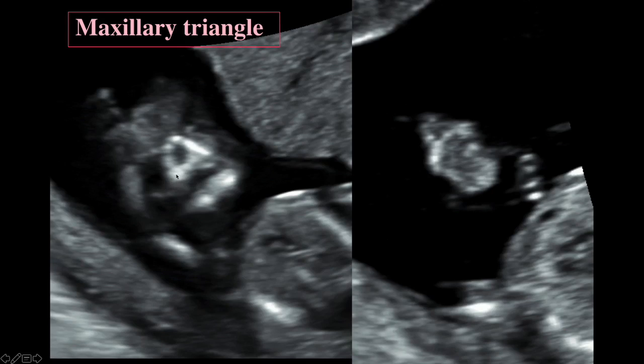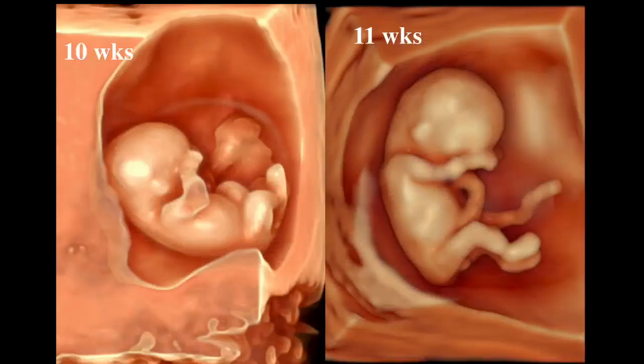And then you come up from it a little bit, and you can identify the upper lip. You're in the soft tissue plane now. You've come forward anterior from your maxillary triangle, and you've got the soft tissues of the lip. These are things that are in close proximity to each other. Just a turn of the transducer will get you all these views as you come in and out of the face from the front and then also from the side.